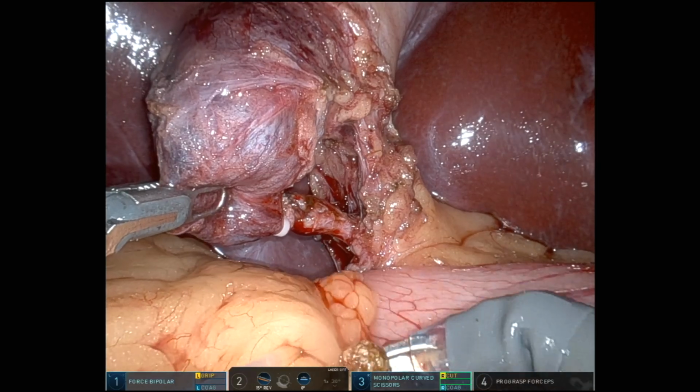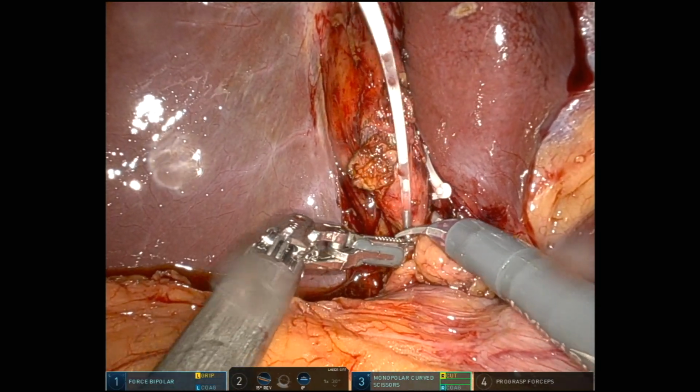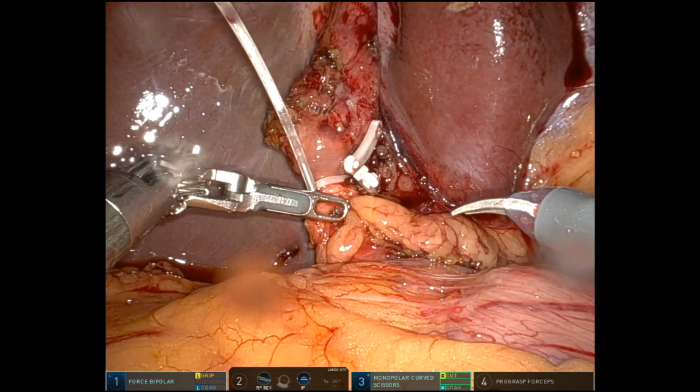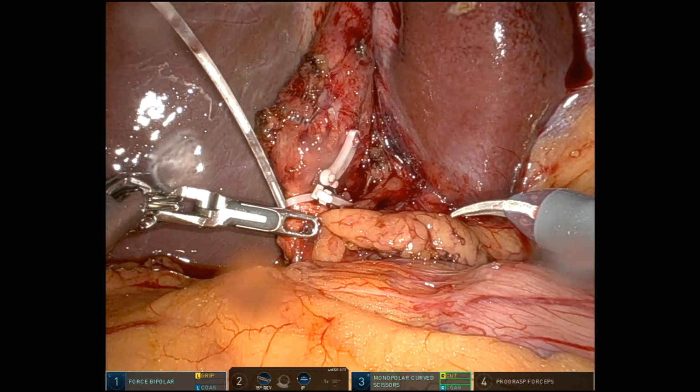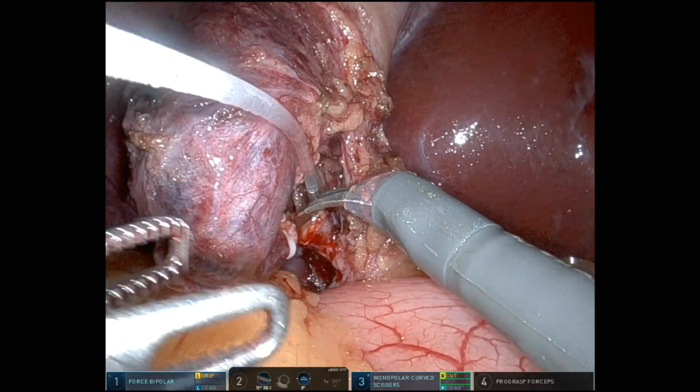The irrigation makes visualization of this maneuver much better, and gentle irrigation can also help you visualize and otherwise discern the actual interior of the cystic duct during other catheter placements.